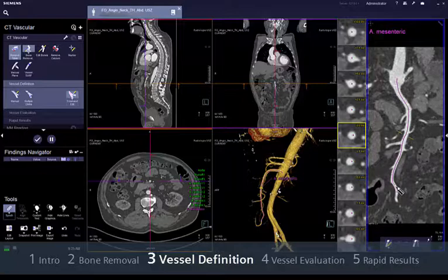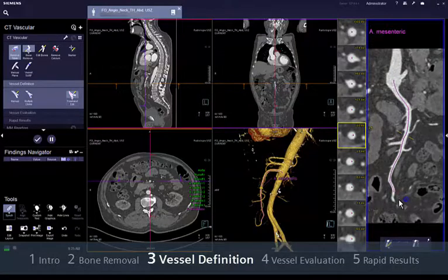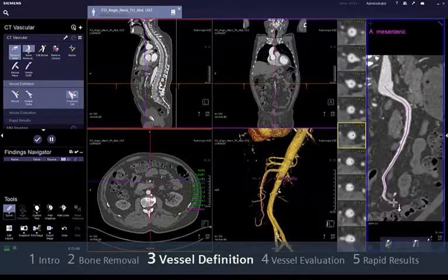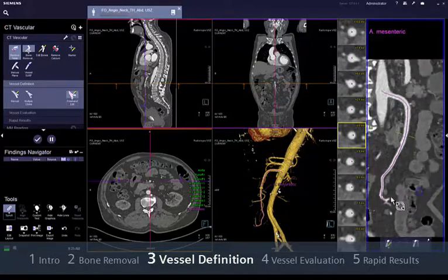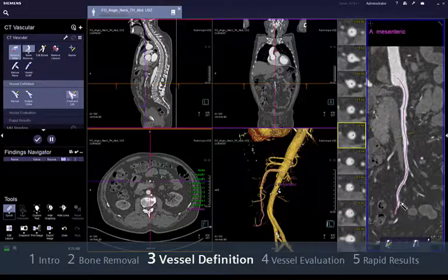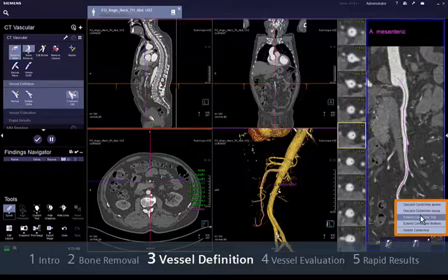You can also extend an existing centre line by clicking over the end point of a centre line — you will recognise it as a thicker point. Then add more points over the vessel with individual clicks and a double click to finish. To see more editing options, right click over the centre line.